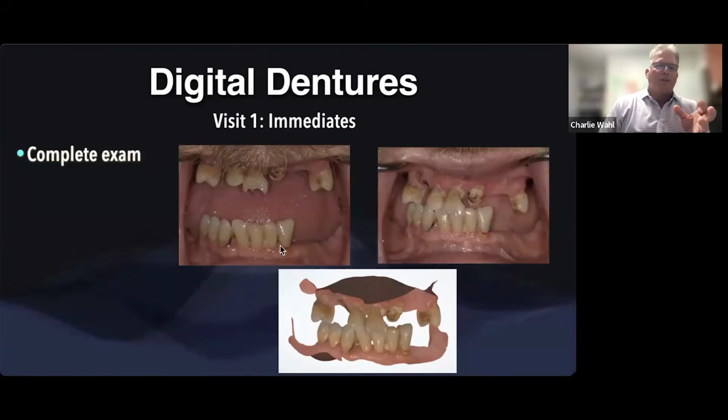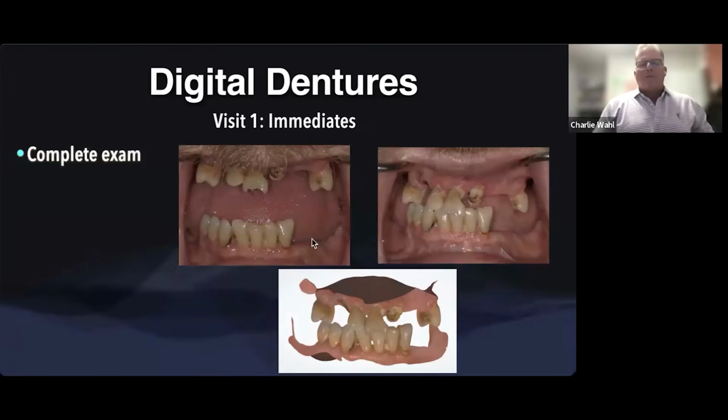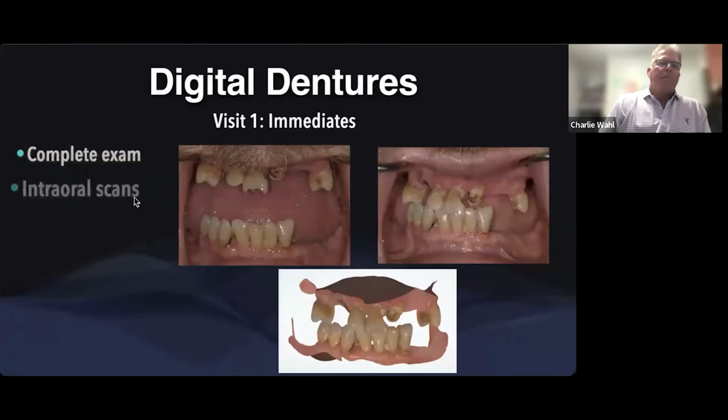I'm looking at teeth like we're trained to do, and we kind of just say, yep, non-restorable, non-restorable, non-restorable. Can't do implants, or hey, maybe we want to do some lower implants, but sure, let's get some scans. But we've learned through experience, hey, let's take our time. And so we'll see in our scans.